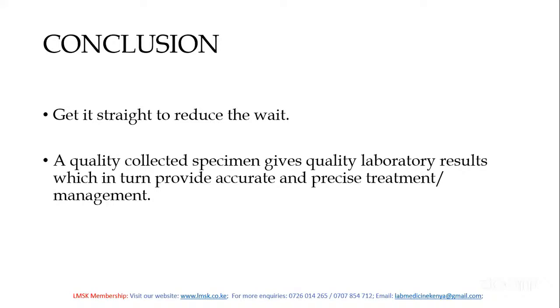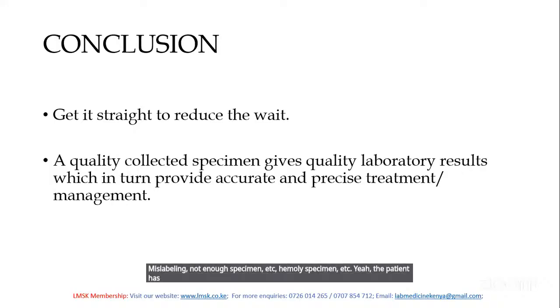Get it right at the starting point to reduce the waiting time, because if you get it wrong, through mislabeling, not enough specimen, a hemolyzed specimen, etc., the patient will be forced to wait, because you'll have to collect another specimen.